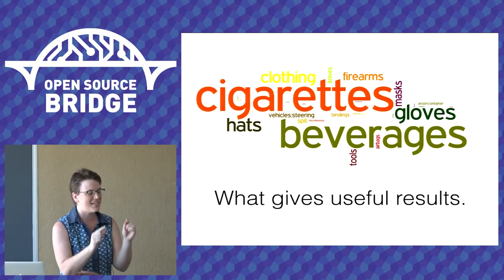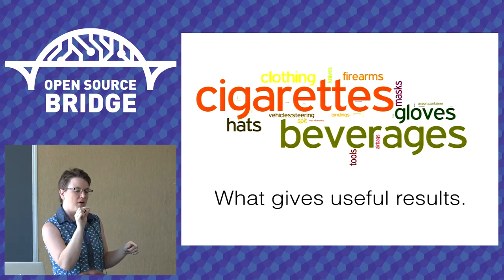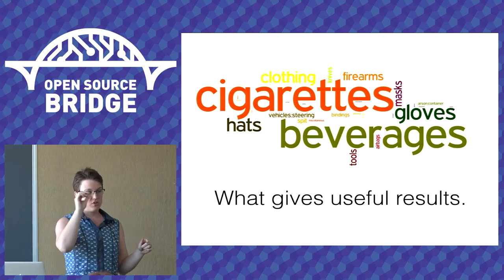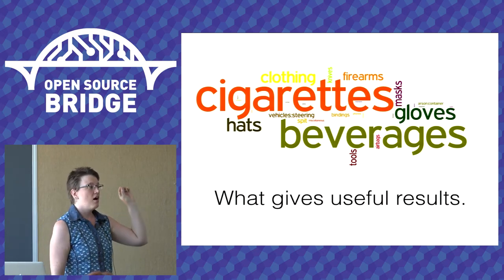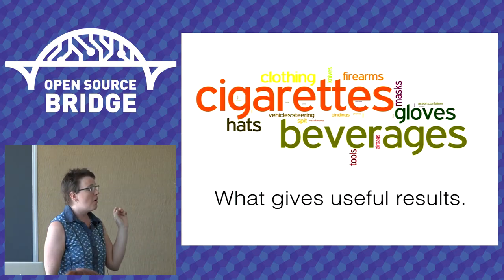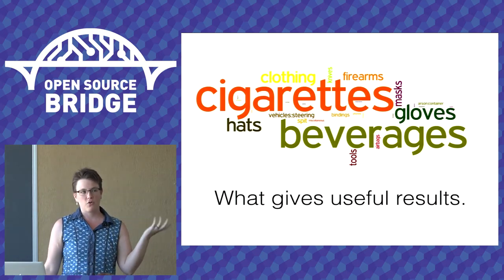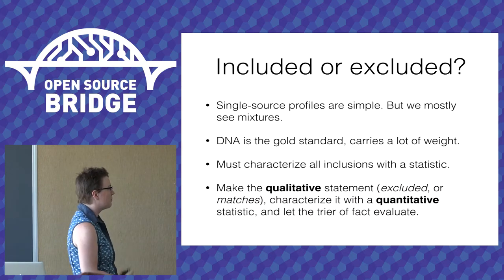I once got one off of a piece of latex. It was like an inch square, I swear to God. I swabbed one side and got the person wearing the glove, and I swabbed the other side and got a full profile of the elderly man that got beaten. It was amazing. However, I have to test like 50 crappy gloves before I get one beautiful glove, but that's what they pay me for.